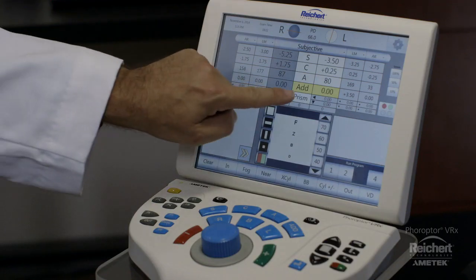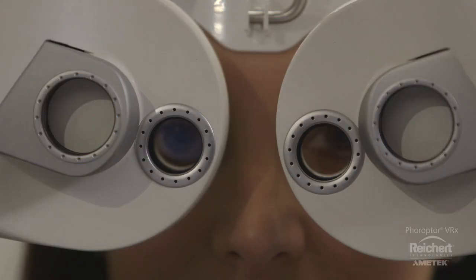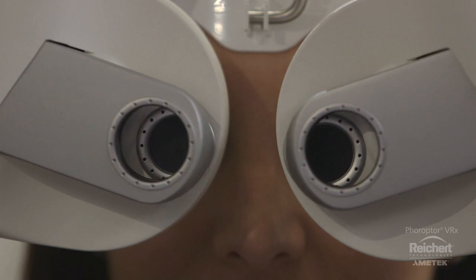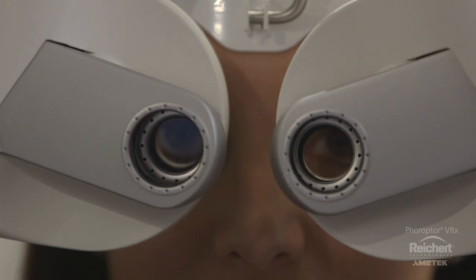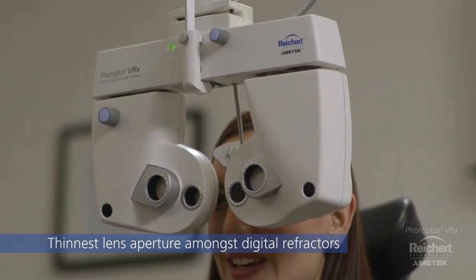To prevent patients from experiencing tunnel vision, Feropter VRX has externally motorized prism lenses that slide in and out as needed. This unique feature gives Feropter VRX the thinnest lens aperture amongst digital refractors.